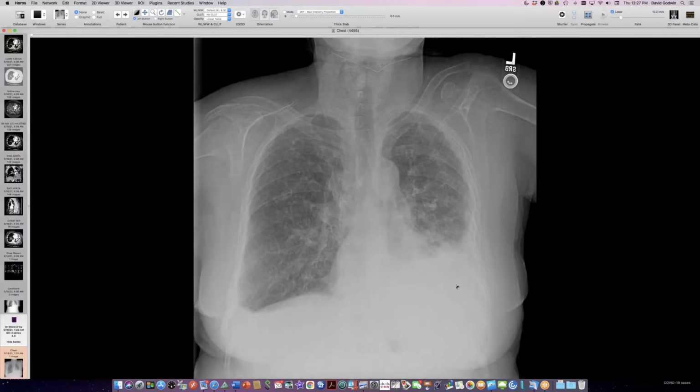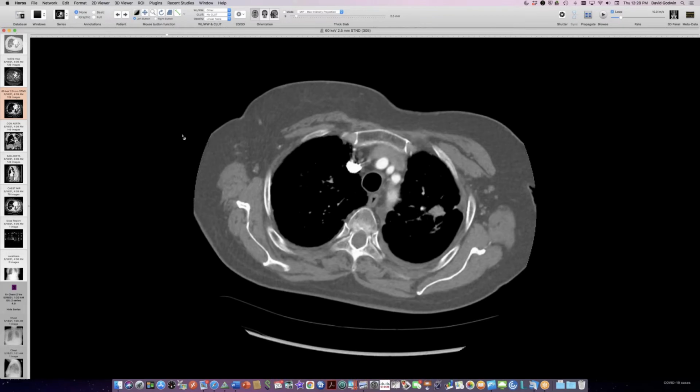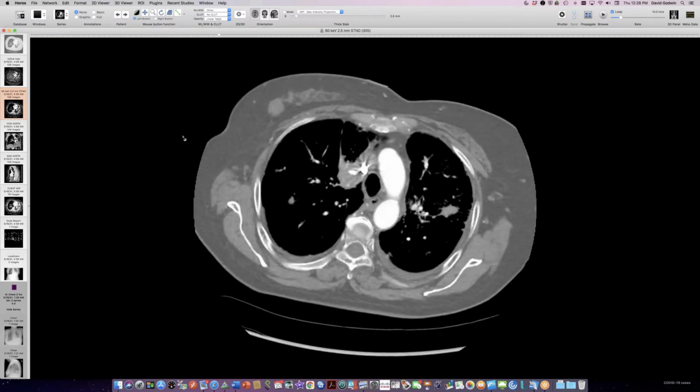And then here's a woman with chronic abnormalities. So she's had pleural effusions. I have seen these pleural effusions over 9 years in this woman. They're currently a little bit larger than they were 9 years ago, but larger left than right pleural effusion, and then some irregular lung blobs. And let me show you what our current CT looks like in this person, who is from Honduras, I think.